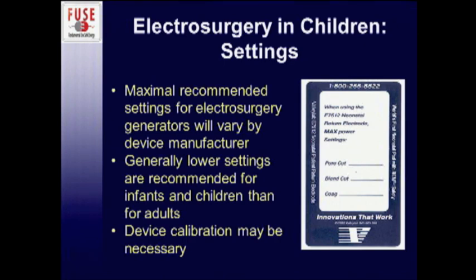Now, again, I have never seen in any of our operating rooms these stickers saying the maximal settings, but it is something that really should be considered when you're taking care of these very, very small infants.